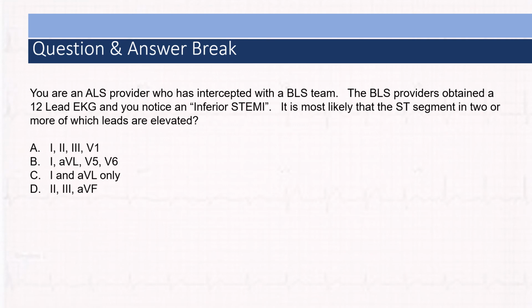B, 1, AVL, V5, V6. C, 1, and AVL only. D, 2, 3, AVF. You answered 2, 3, and AVF. You are correct.